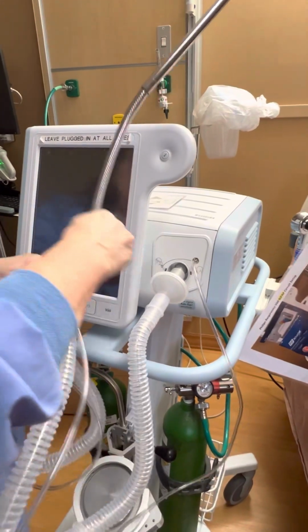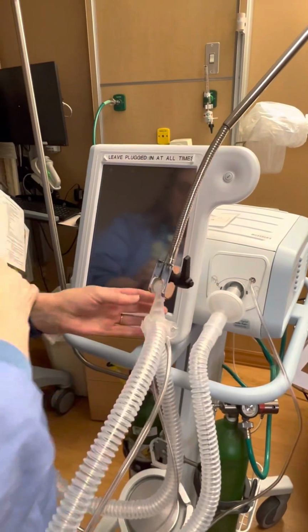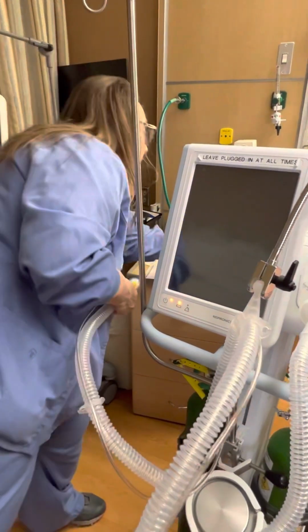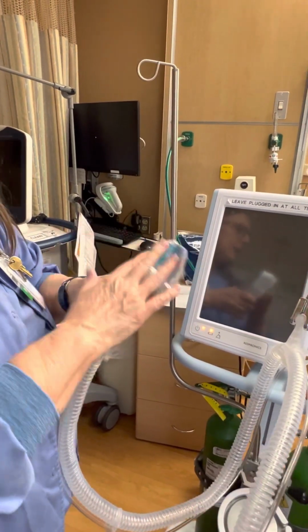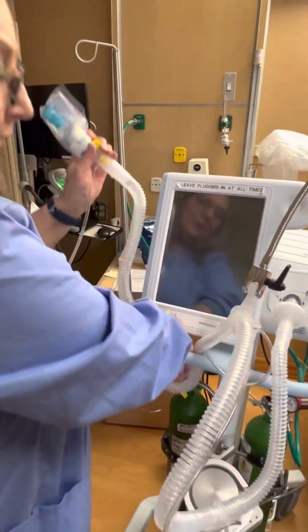you hook this on here, you put your HME on here and your small cuff, and then I try to keep the little baggie from it, just so I have something hanging over it. If you forget, throw a glove on there or something, just keep the dust out of it. Hopefully there's dust, that we don't use it that often.